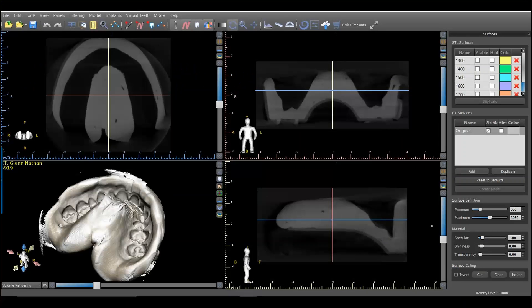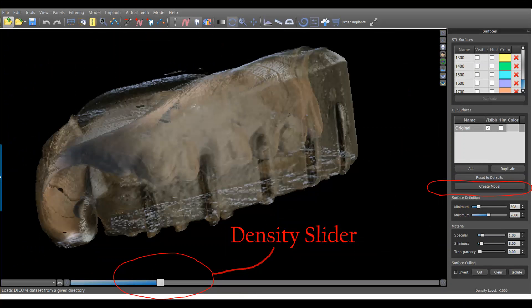Here we see the DICOMs of the cone beam scan of the impression opened in the Blue Sky software. A couple of things to be aware of: we have the density slider at the bottom of the 3D rendering window, and we can adjust the density to vary the appearance of the 3D rendering. On the right-hand side we have the ability to click 'Create Model,' and however the impression appears on screen at that density, it will generate an STL model of that impression.